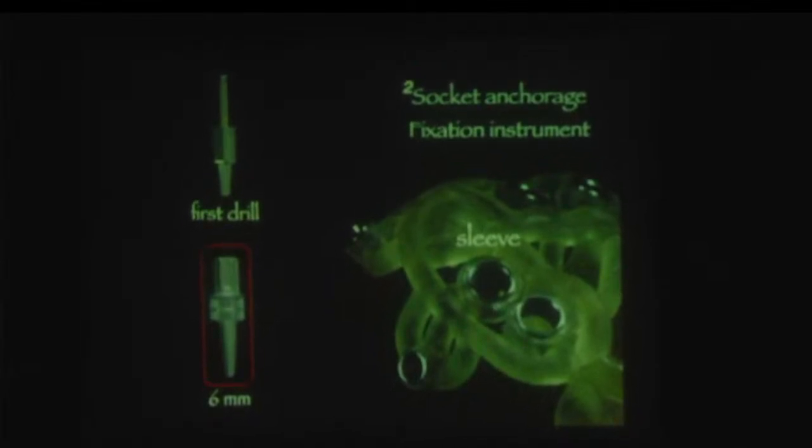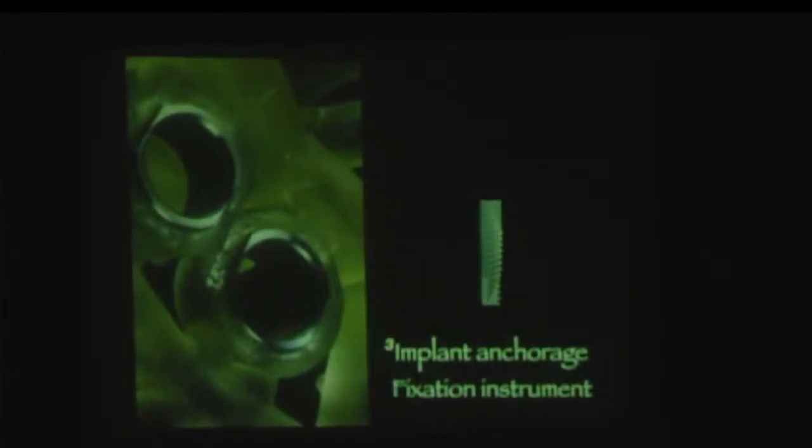This is the second way of fixating the guide to the upper or lower jaw, especially in edentulous cases. The second and the third fixation alternatives are so important. Look, we make the fixation pins, and after it we make the osteotomy, and we open the fresh socket, and we make the fixation with the number 2 instrument.